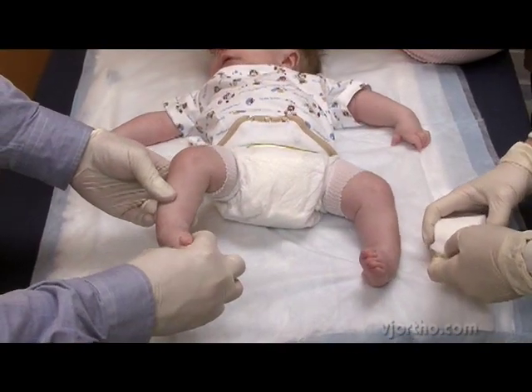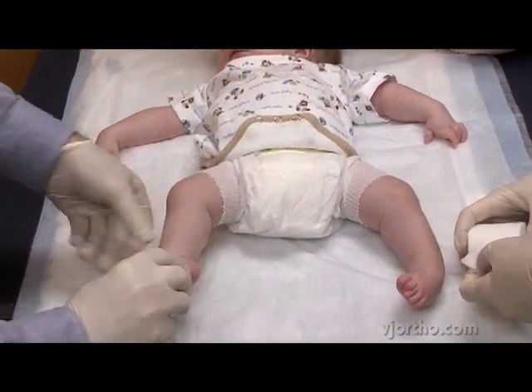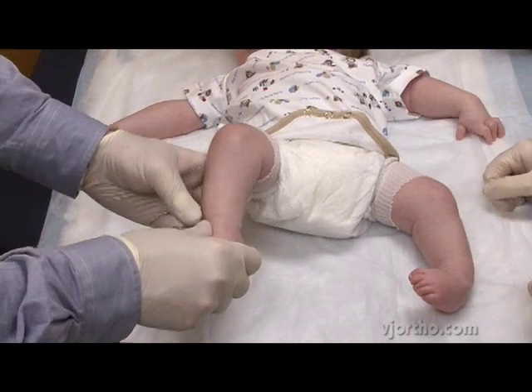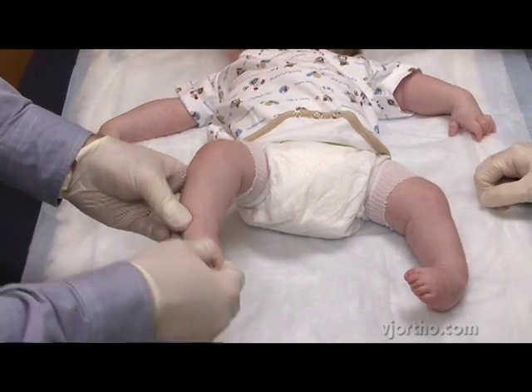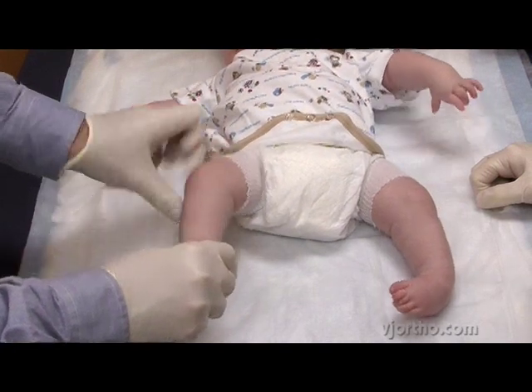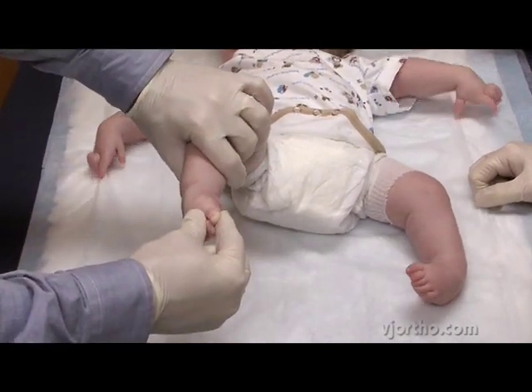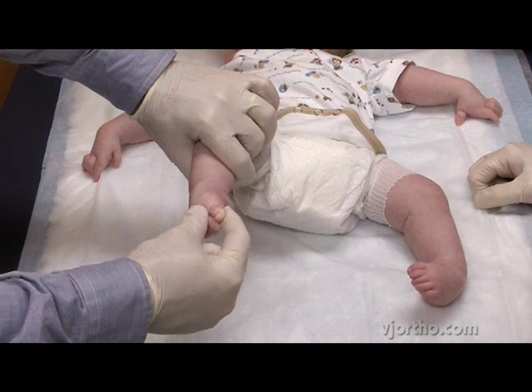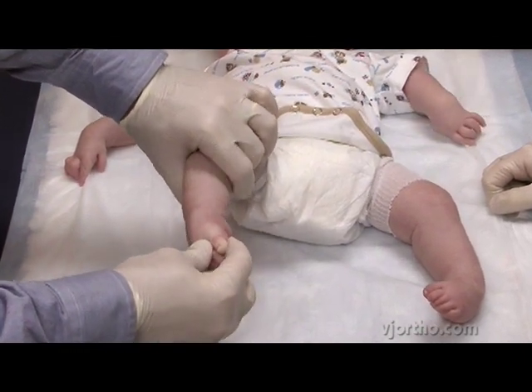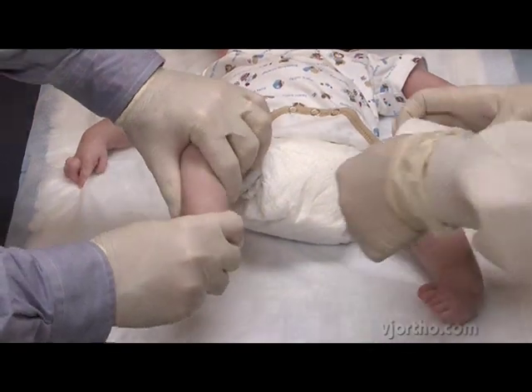So the first cast that we use, we supinate the foot. The point of that first cast is to correct the cavus, or the high arch, which is mainly in the first ray. We do a few seconds to a minute of manipulation each week. The first cast will be applied today with the foot in the extreme supinated position, with our index finger underneath the first ray to help correct the cavus deformity.